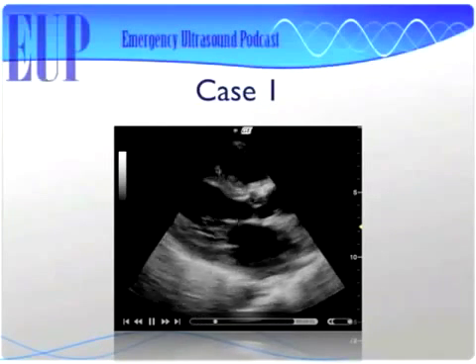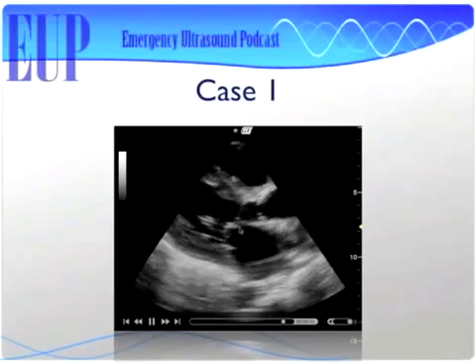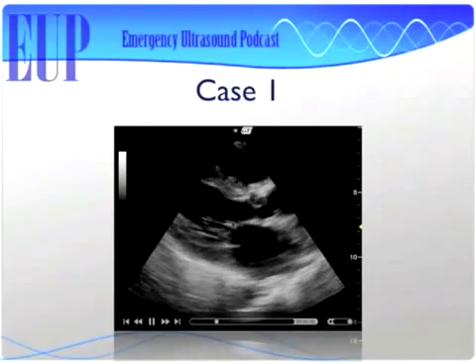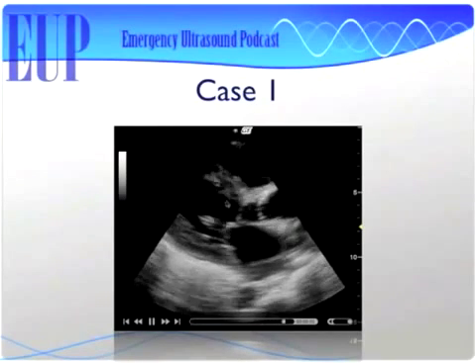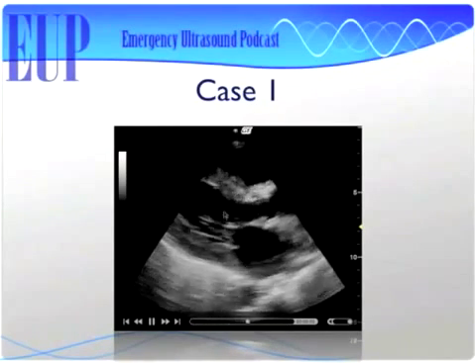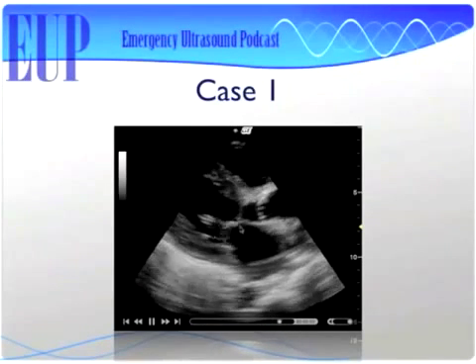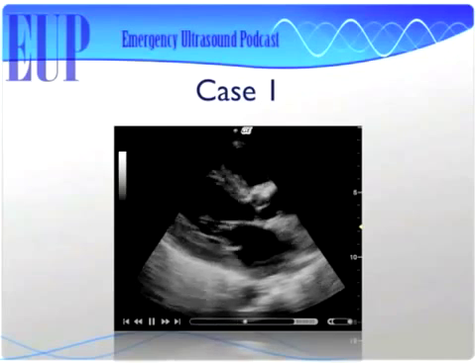I see an aortic and a mitral valve that are not opening appropriately. So here, the anterior leaflet of the mitral valve right here, you're saying that's not coming up and touching the septum like you would want it to. That's not what I said, but yes. Okay, that's what you're getting at, though. You're saying that anterior leaflet of the mitral valve, putting words in my mouth.